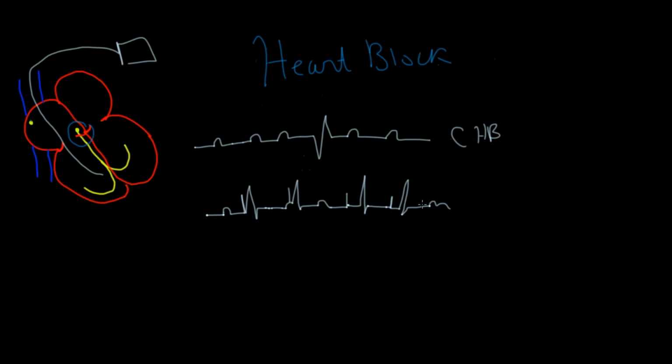So what we use at this stage is still a dual chamber pacemaker. So this is the second lead, goes all the way as usual. Sorry, that should go in the atria. Ignore this last bit.